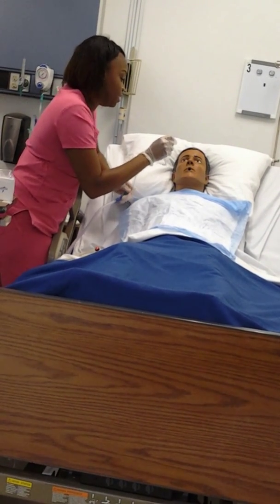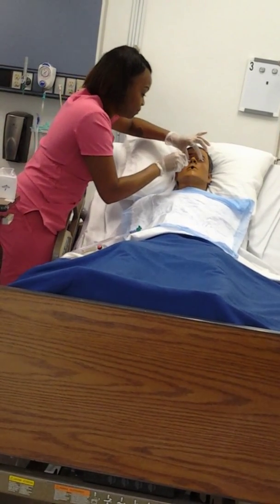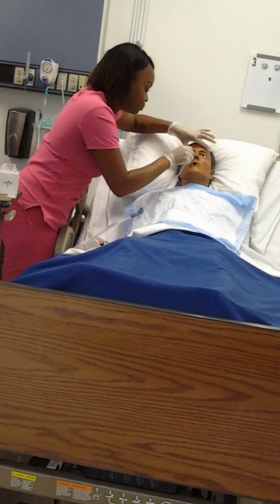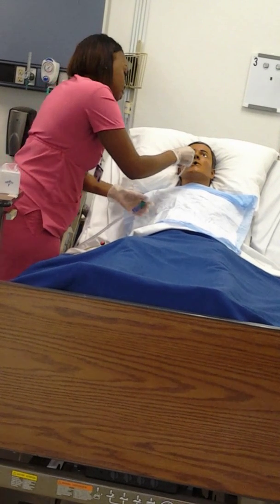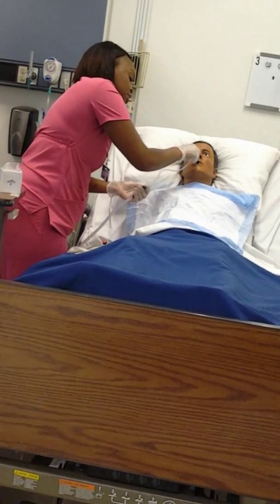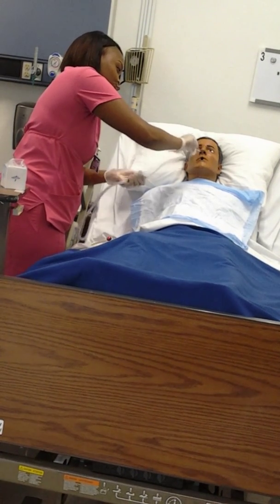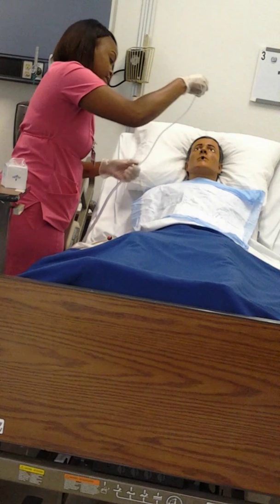I'm going to go in on the count of 3. 1, 2, 3. Going in. Going in the direction of the opposite ear. I'm going to go in about 5 inches. She's starting to cough. I'm going to go ahead and suction. Gone.